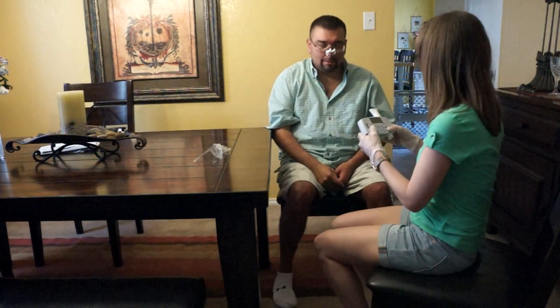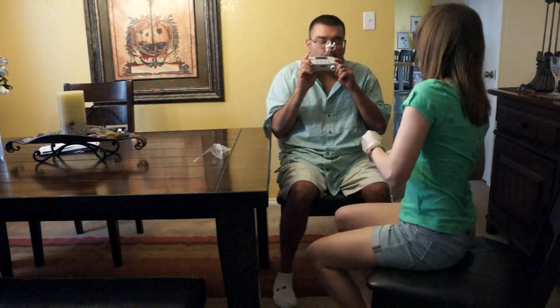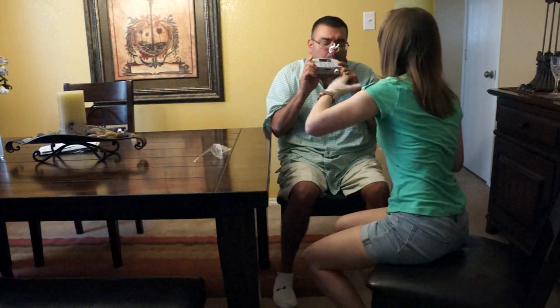Okay, ready? All right. Okay, big deep breath in, all the way to the top. Blast out, hard and fast. Go, go, go. Keep going, keep going, keep going. Go, go, go. Keep going, keep going. Good. Go ahead, come up.